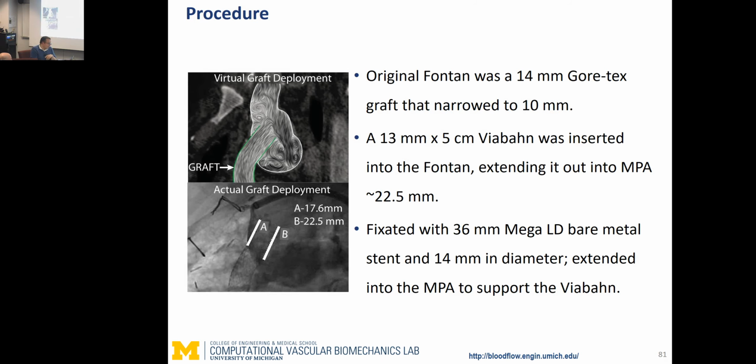So they did the procedure 4 days later, and you're looking here at an image after the procedure. This wire that you see here is the stent graft. These guys are incredibly skilled with their hands. This is the sternum of the patient. Whenever you see these kinds of rings, they are metal rings that try to keep the sternum tight after it was opened many times.